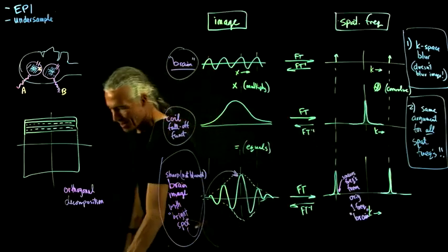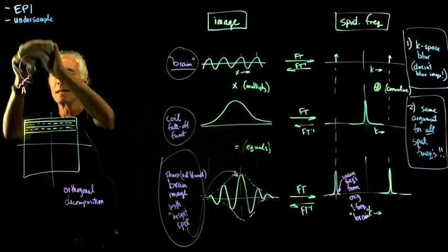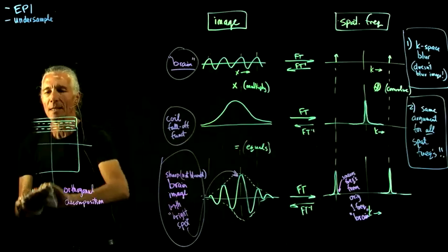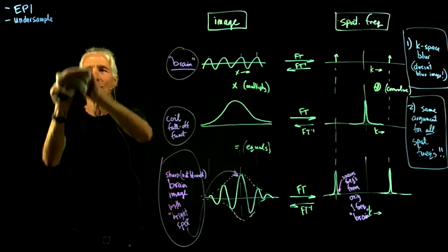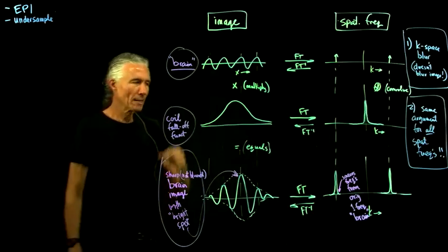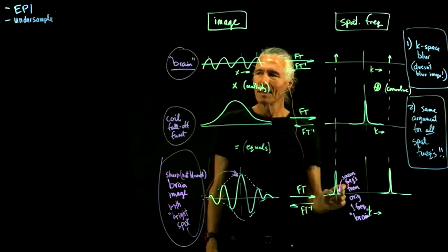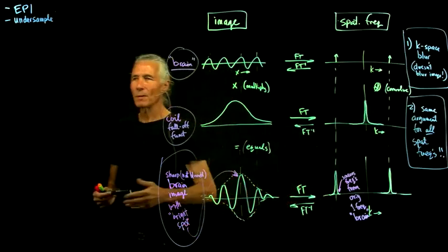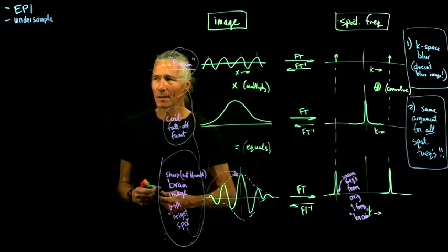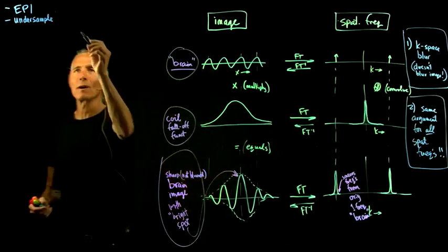So what does that suggest? Well, it suggests we've got a way to interpolate those missing data points, because some of the frequencies have been smeared into the adjoining frequencies. There's a bunch of different ways of trying to reconstruct missing data, and I'll just talk about one.